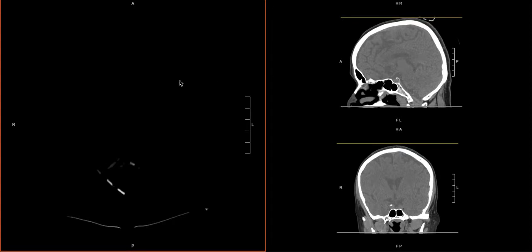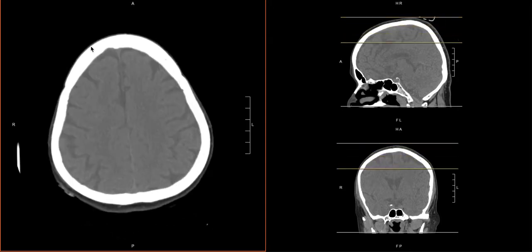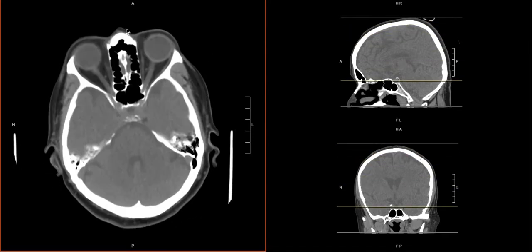We'll start at the top of the head. The approach that I take is to go in quadrants. So I'll start with the anterior, then I'll go lateral, then I'll go lateral on the other side. Then we can do posterior, and we can cover all of our bases. So as you're looking, we're just looking along the anterior surfaces here.